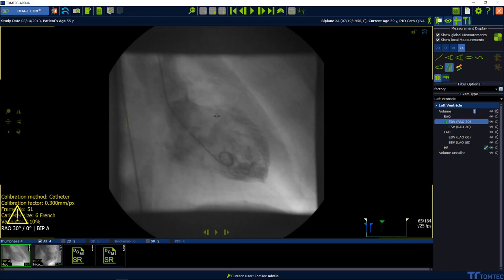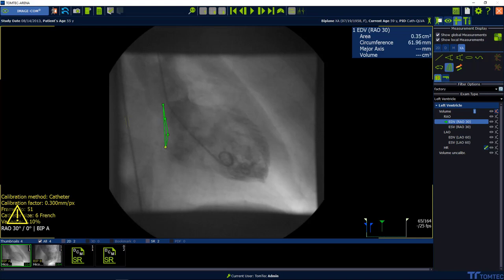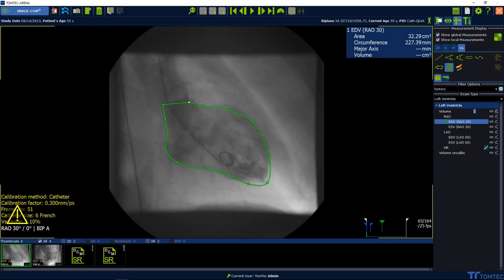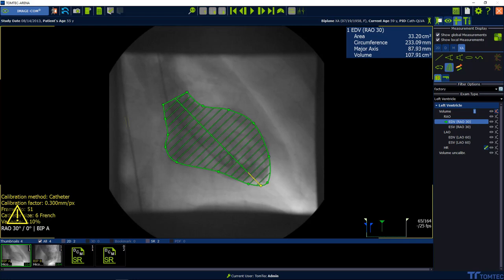Start with the end diastolic volume. Step one: start drawing the contour on one side of the annulus using left mouse clicks. Step two: complete the contour on the opposite side of the annulus using a right mouse click or a double click.